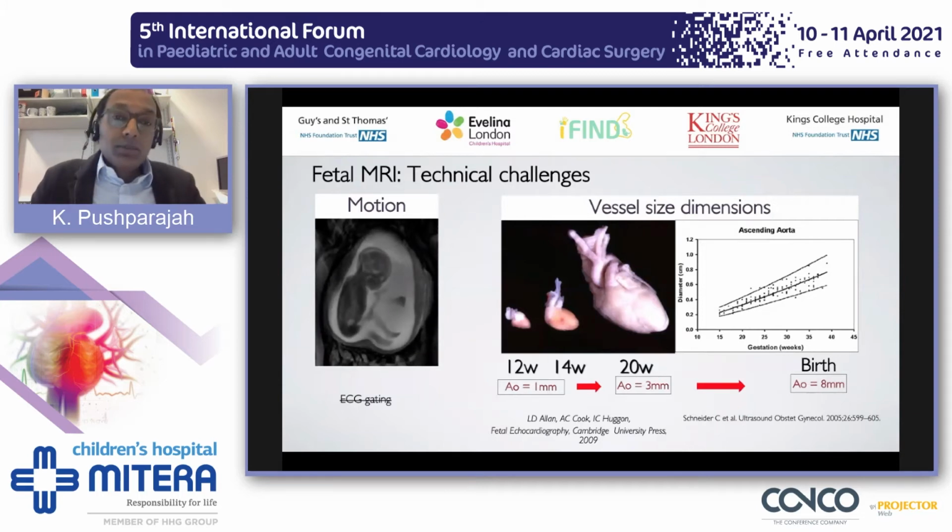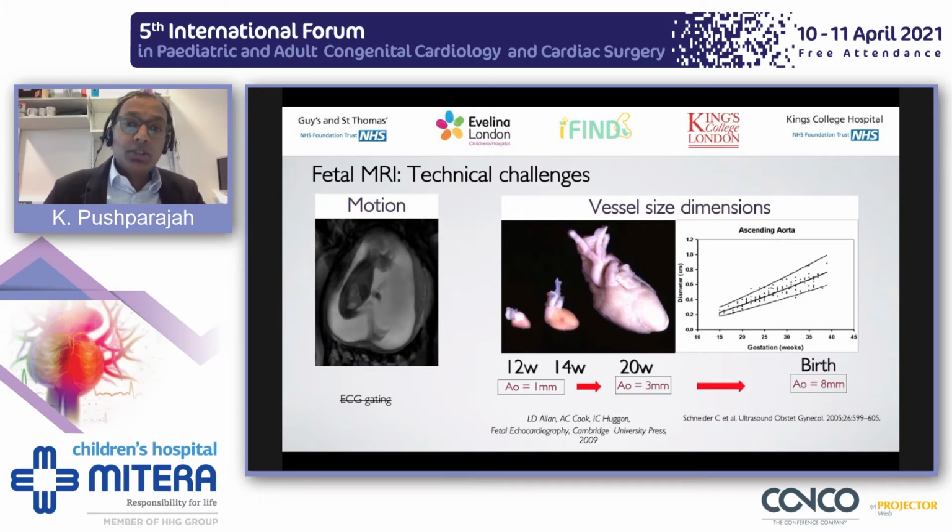So in terms of what I do, we do fetal imaging for the heart, and actually it's working with expert radiologists like the previous speaker. They've been imaging the thorax, the brain, and all the other bits of the fetus for ages. But cardiology, or the cardiac imaging, has always fallen behind. Because we have this really mobile fetus without ECG gating, and remember, all your postnatal imaging is based on having ECG gating. We're not able to do that in the fetus. You've also got very small vessels, as you'll see here from my slide. So it becomes very challenging in terms of motion and spatial resolution.